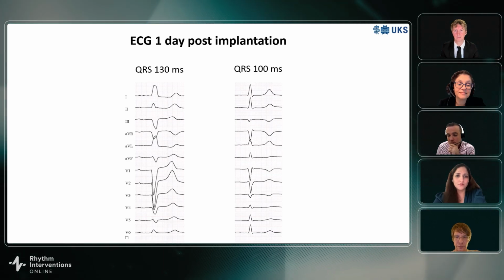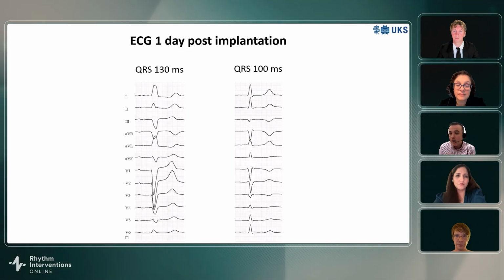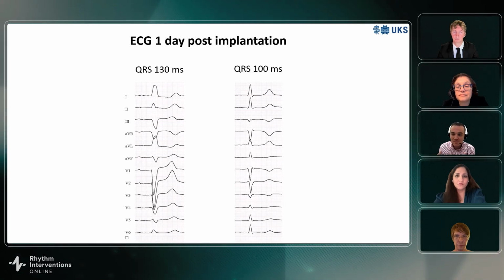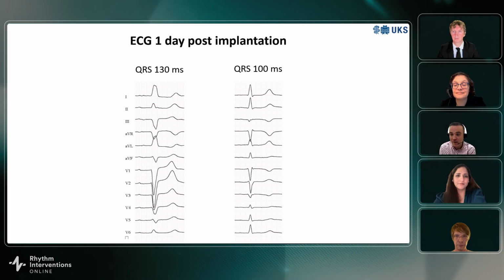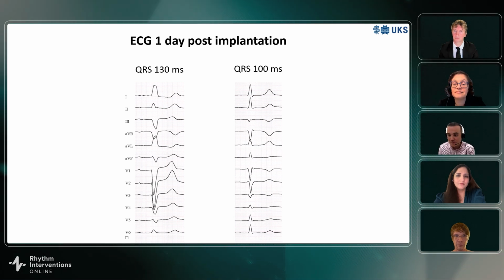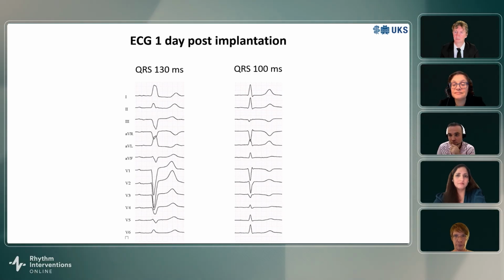We are working at a University Hospital in Germany, and we only have this option, the 12-lead ECG in our pacemaker lab. However, we are still able to perform a good LBB case. That's why I wanted to show this case. Also, as a proctor, I'm Syrian, and I implanted many left bundle branch cases in Syria, where we only had this opportunity, maybe a 12-lead ECG. That's why we have to be sure, using this material, that we are performing a good LBB case.